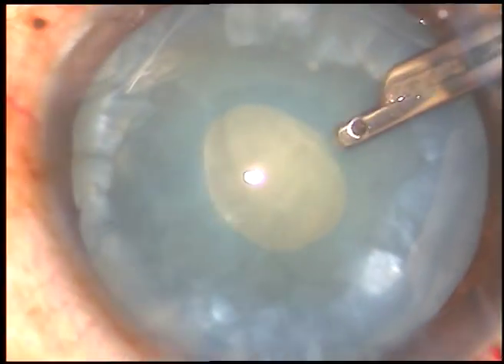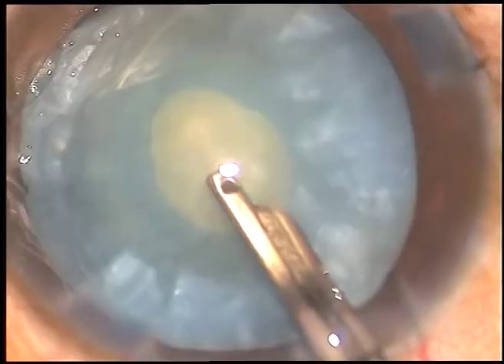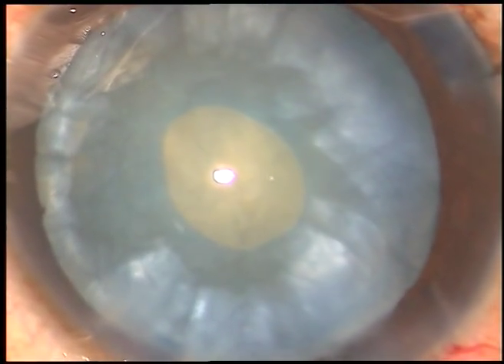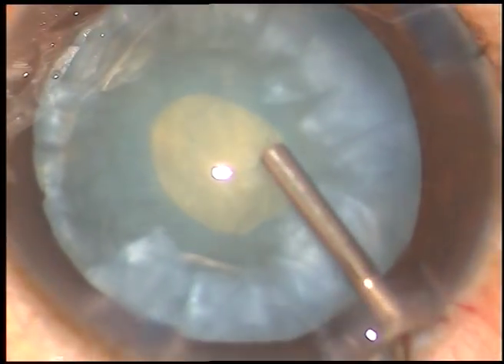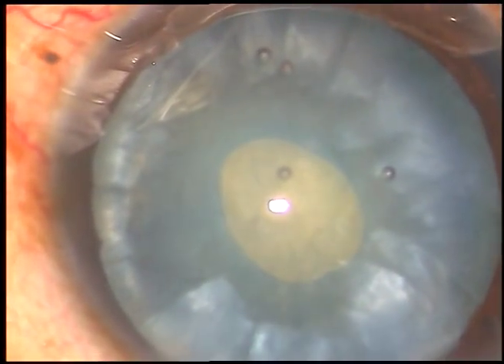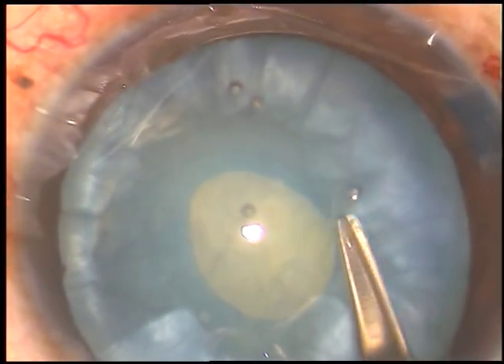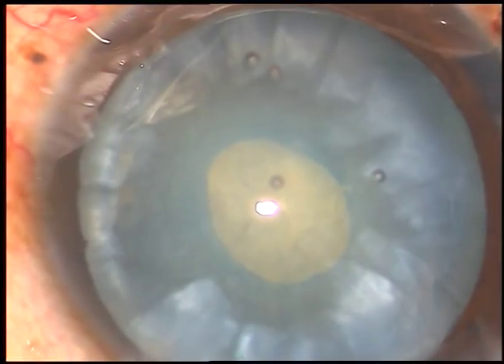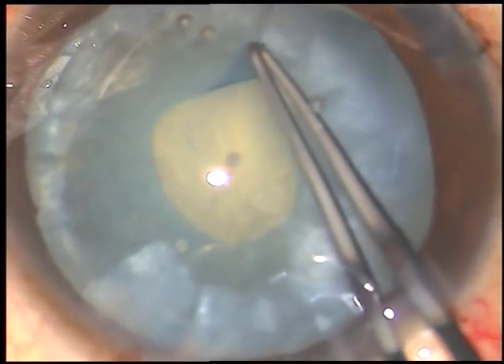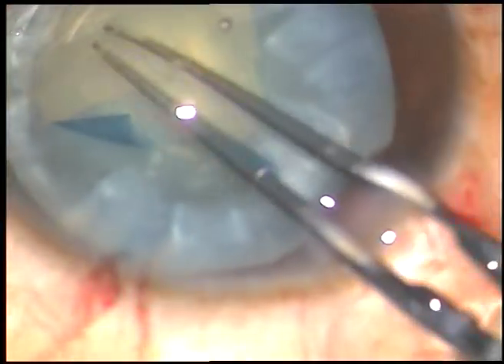This is a 23-gauge Simcoe cannula. You can use bimanual IA also for removal of some cortex, and that will reduce the intra-lenticular pressure. Once the intra-lenticular pressure is reduced, you inject viscoelastic substance again and enlarge this small rhexis into an optimum sized one. Enough cortex has been aspirated from different points. And now hydroxypropyl methylcellulose is injected. Now a Vannas scissor is taken and a small cut is made here.